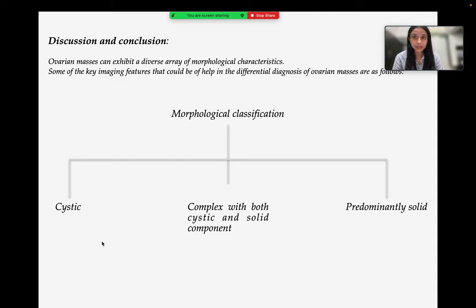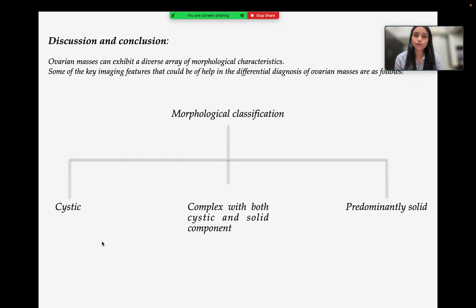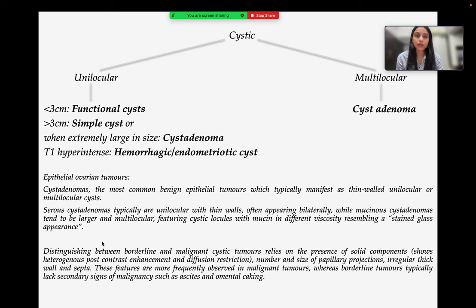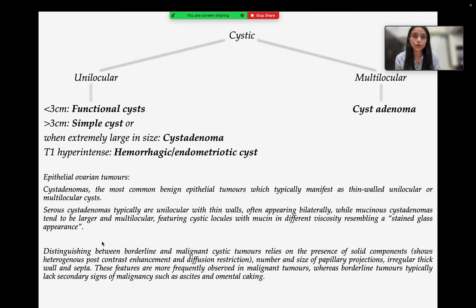Ovarian masses can exhibit a diverse array of morphological characteristics. Key imaging features helpful in differential diagnosis include morphological division into cystic, complex (both solid and cystic components), and predominantly solid categories. When cystic, the lesion can be unilocular or multilocular. In unilocular lesions, those less than 3 cm are likely functional cysts; those greater than 3 cm can be simple cysts, and extremely large ones suggest cyst adenoma. Presence of T1 hyperintensity within the cyst indicates a hemorrhagic or endometriotic cyst. When multilocular, cyst adenoma is favored.